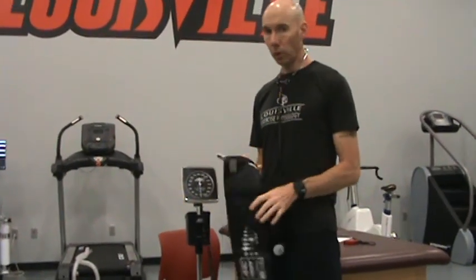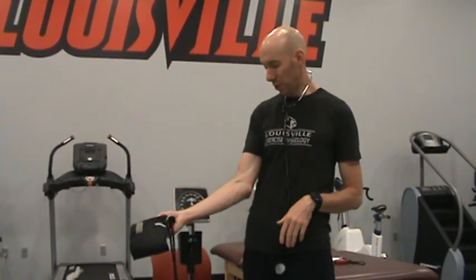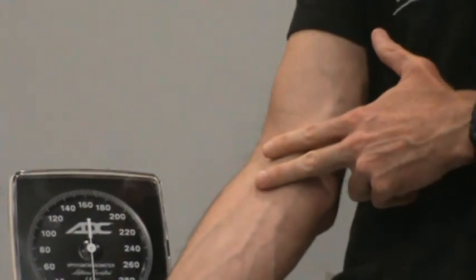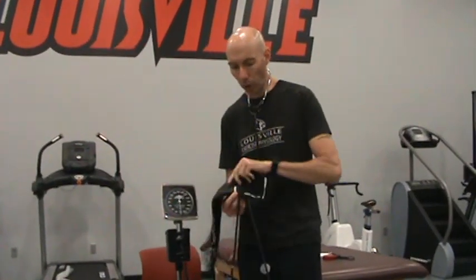Now I mentioned the artery. What we're going to do is locate the brachial artery of the subject. There are several different ways you could do this. You could do that through auscultation using the stethoscope, so you would find the brachial artery and listen for a heartbeat that is found there. To be honest with you, it's kind of difficult to hear a heartbeat there often. Another way to find it is just to look to see if somebody has very superficial veins like I do. Usually you can see that big vein that comes right at the crease of the elbow, and the brachial artery is often right below that. So a couple different ways you can find the brachial artery. And again, you want to make sure that this mark is lined up over it.